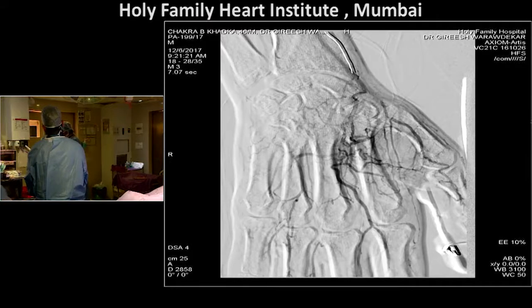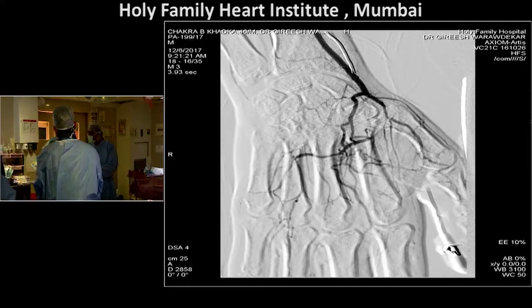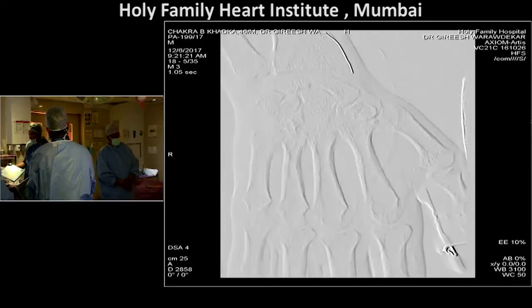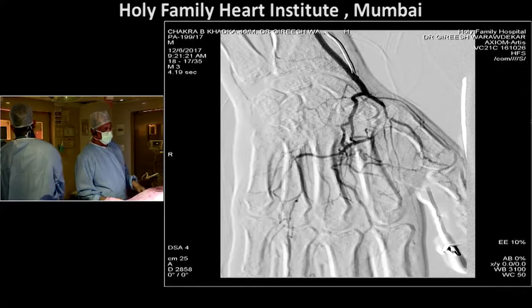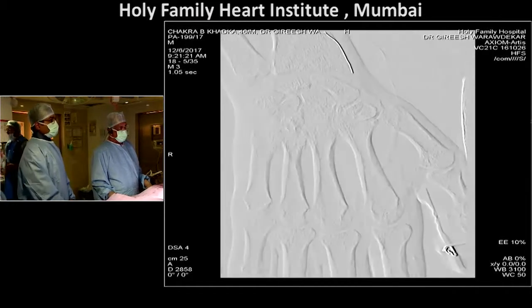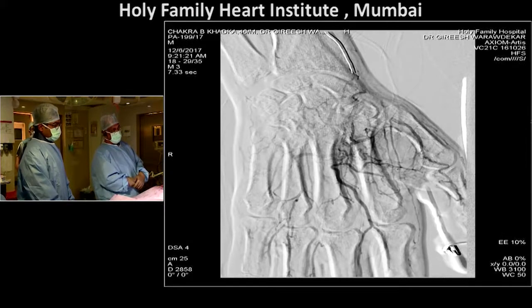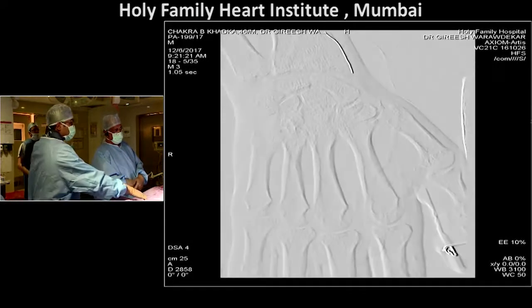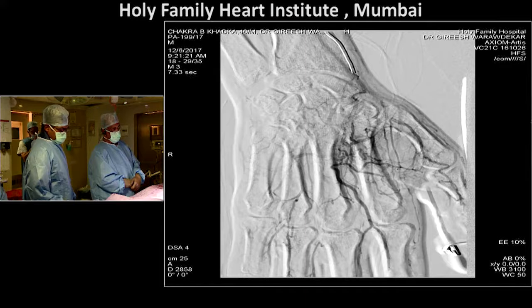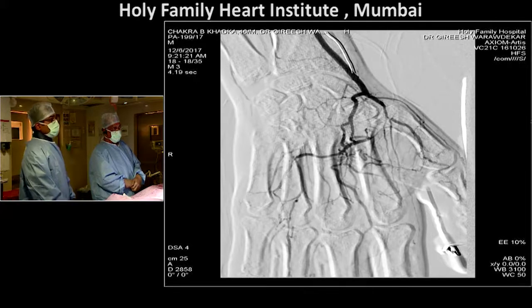You have a comment, sir? I was thinking, do we consider doing something for the ulnar artery? Because obviously this thrombus is riding above the bifurcation between the radial and the ulnar. And what we can see is this is the fifth finger, which is usually supplied by the ulnar. When we pass through the bifurcation, through the lesion, the ostium of the ulnar artery is compromised, so maybe we should see the initial pictures and see how big it is and whether it is worth treating the bifurcation.